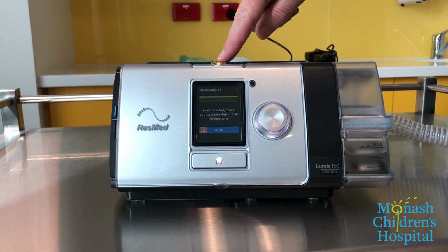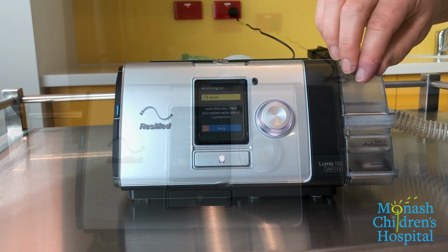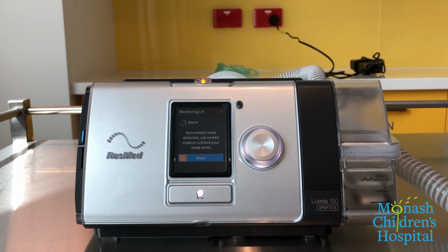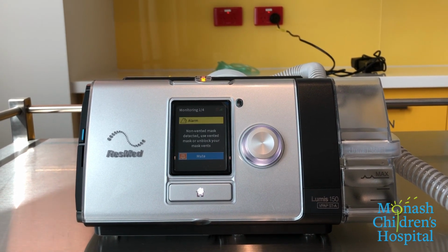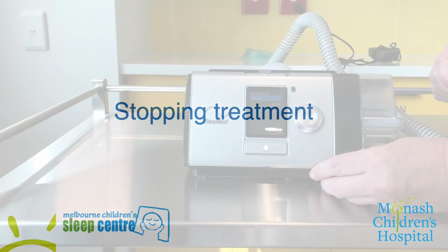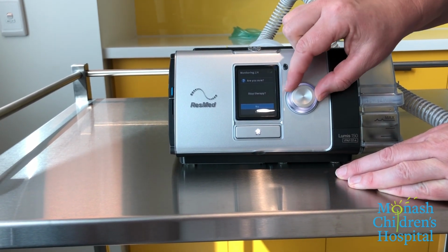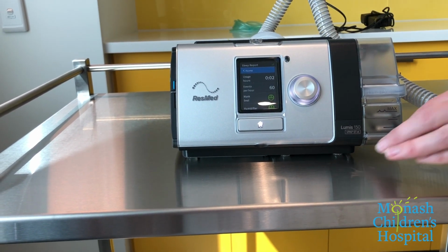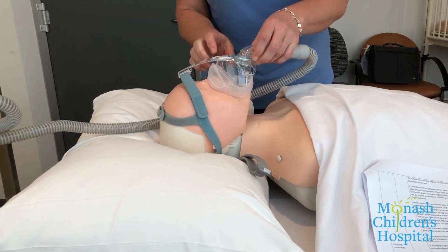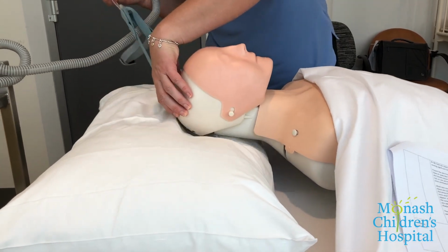The most common alarms are high leak, which means a part of the circuit has become disconnected, or non-vented mask is detected when the exhalation ports are blocked or an incorrect mask is being used. If stopping or pausing treatment, turn off the machine and immediately remove the mask. The mask should be removed by releasing the minimum number of straps or clips possible to make it easier to put the headgear back on when treatment is restarted.